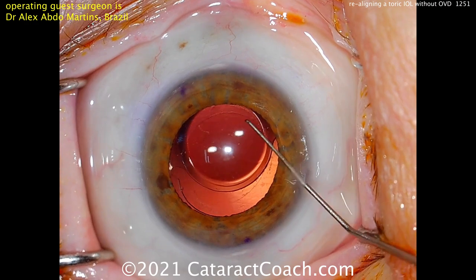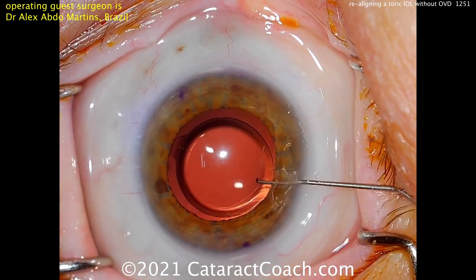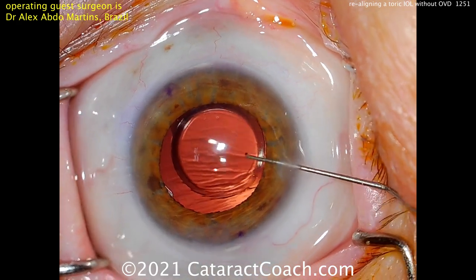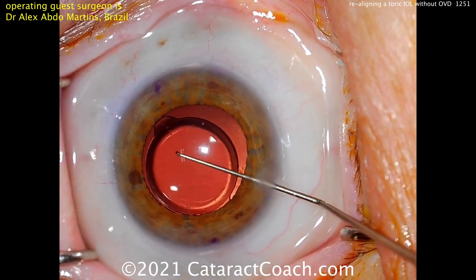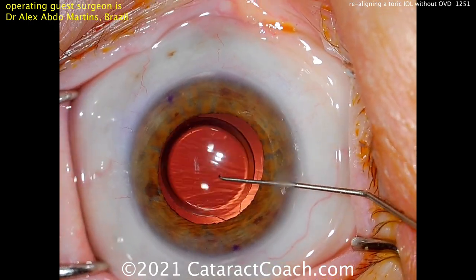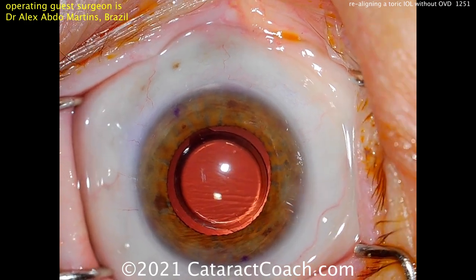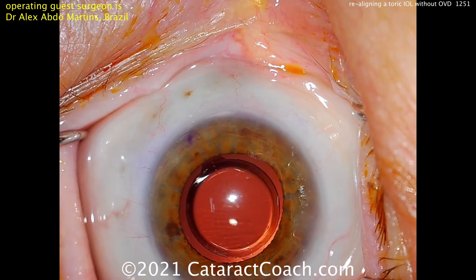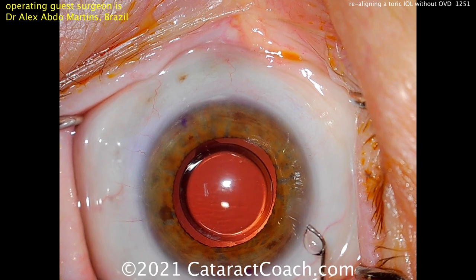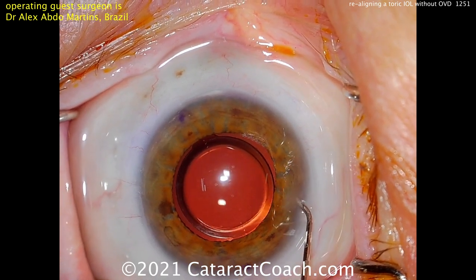The other option is to have a second pair of instruments and put an infusion port in the eye — a bimanual infusion port — which makes it easy as well. Getting the lens rotated a little bit more. All these single-piece acrylic lenses are easier to rotate clockwise because of the haptic orientation — much tougher to rotate counterclockwise. More BSS going inside to keep the eye full.